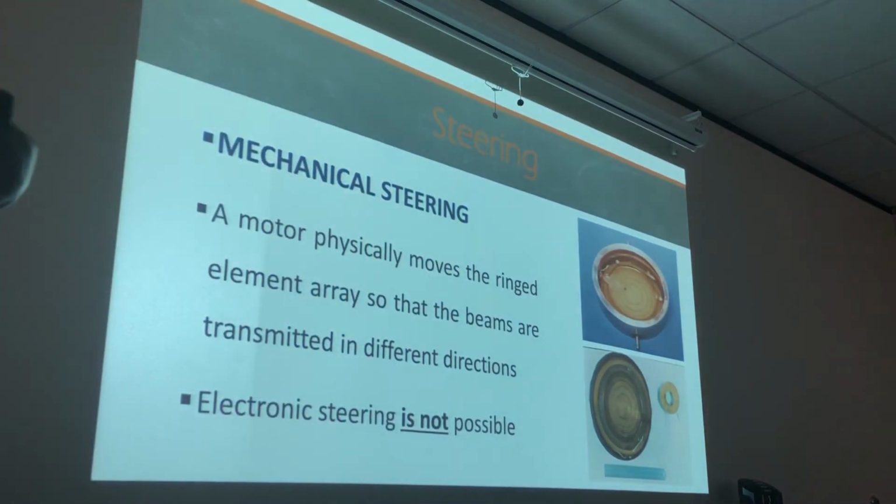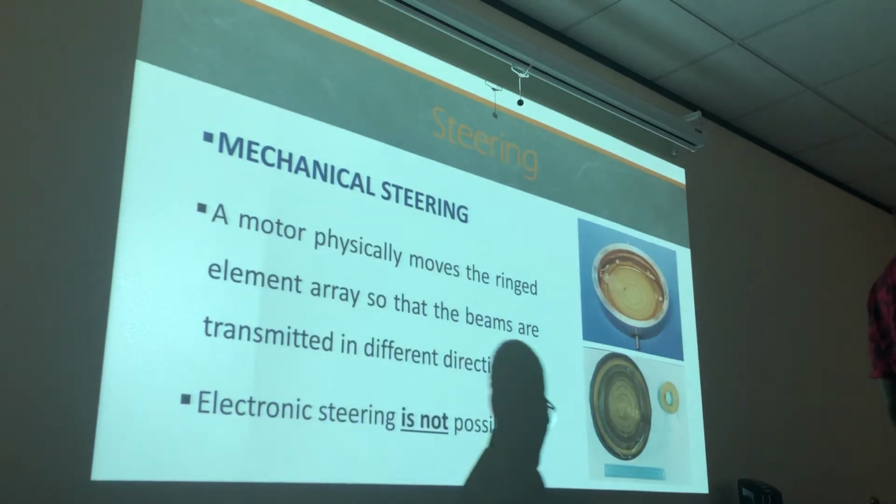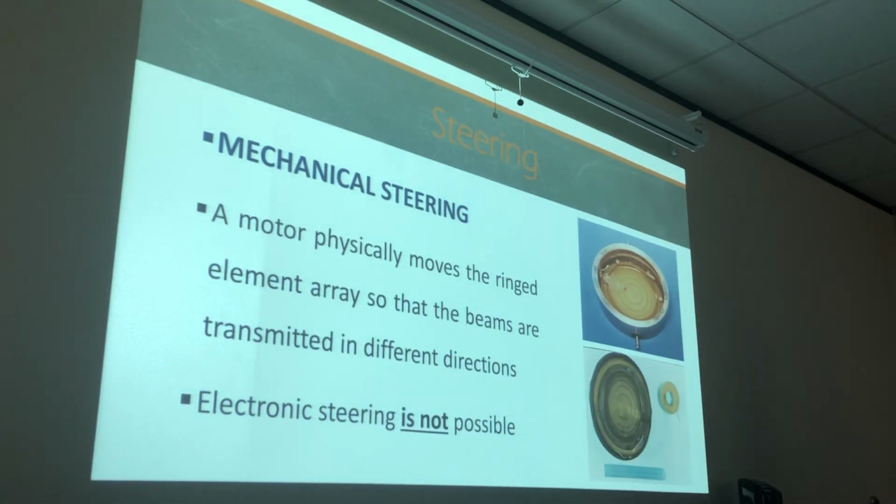Okay. But it's an array transducer. Why is it an array transducer? Why is this annular phased array an array transducer? No, it has multiple elements. It has multiple elements. Wasn't a trick question. Okay. So that's steering, guys. Major thing, mechanical steering. Anything in bold, that's what I really want you guys to know.